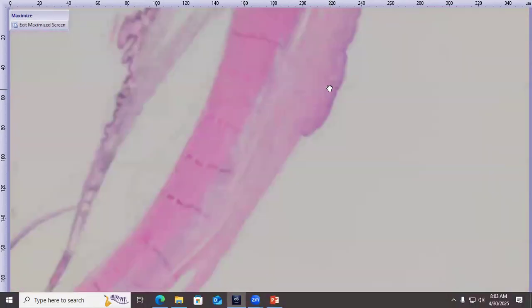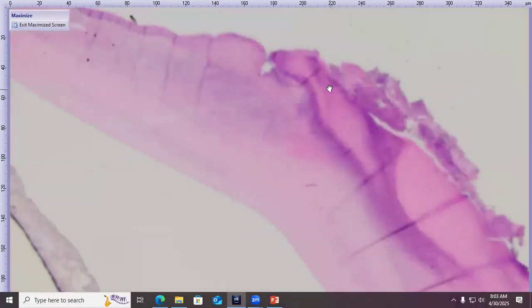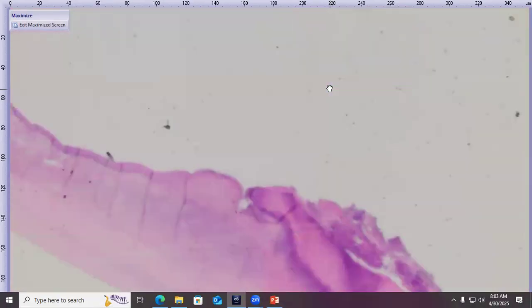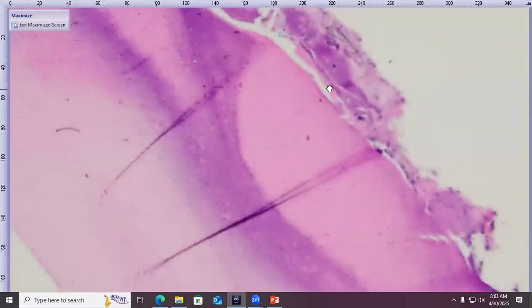All right. Focus, there we go. All right, so the globe's been rotated now. The cornea is going to be on the right. Posterior segment will be on the left as I move this way. But we'll just start with our corneal changes. Focus. There we go.